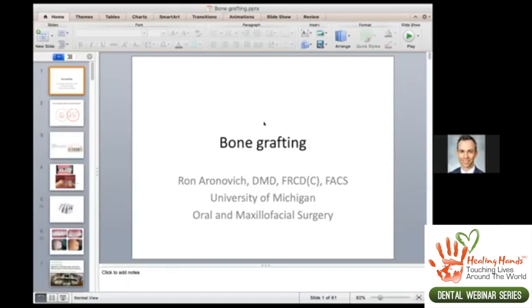So I'm going to make sure that as the replacement substitution process happens, as the bone heals and remodels around the implant, we don't lose that labial plate. And in that case, I think it works pretty well.